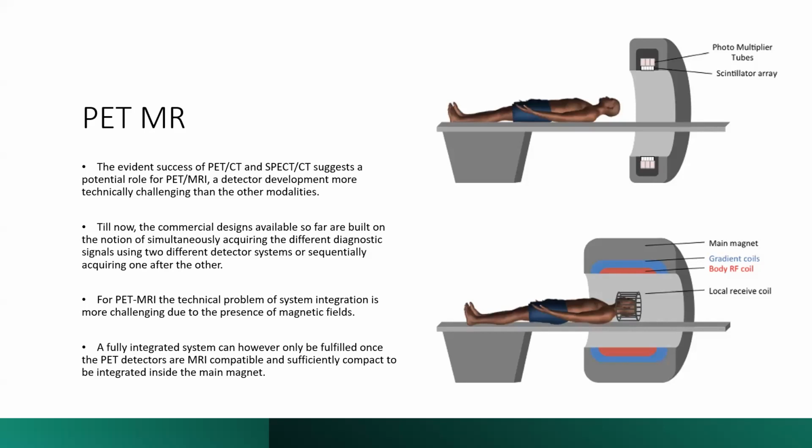Of course, CT has a big role in PET-CT, but there are applications, for example brain, breast, prostate, and abdomen, where the additional information delivered by CT is limited. MR offers better soft tissue contrast, and also the dose given to the patient during the PET-CT scan is eliminated in MR, because MR does not give a dose to the patient.